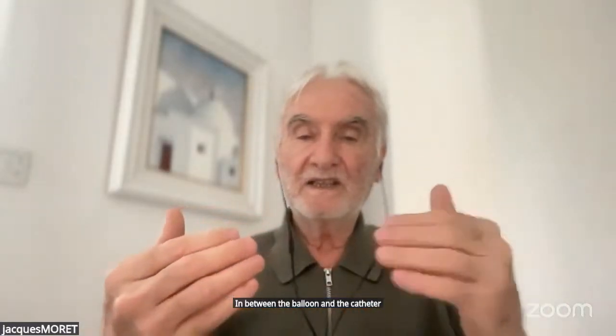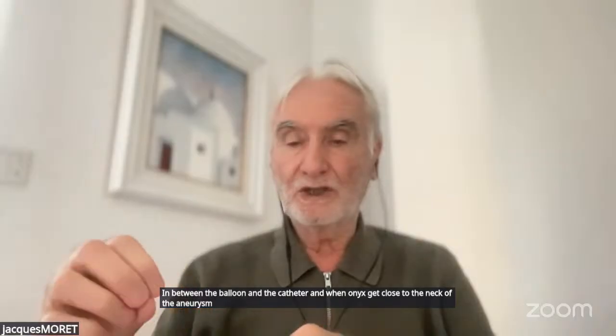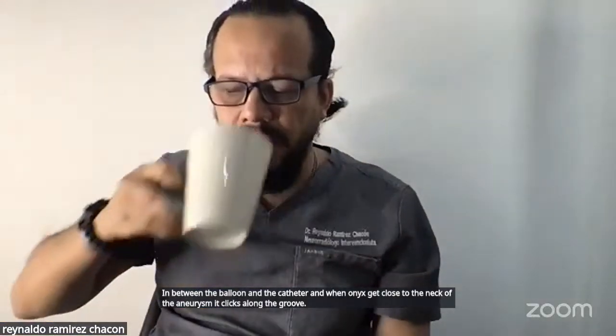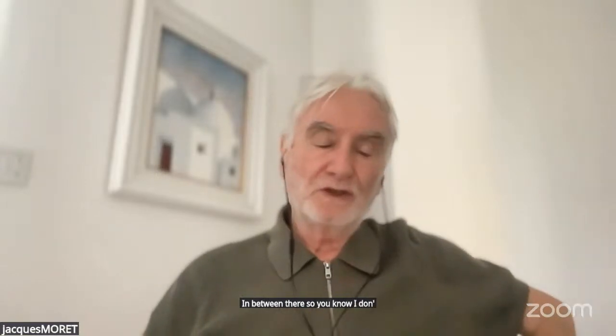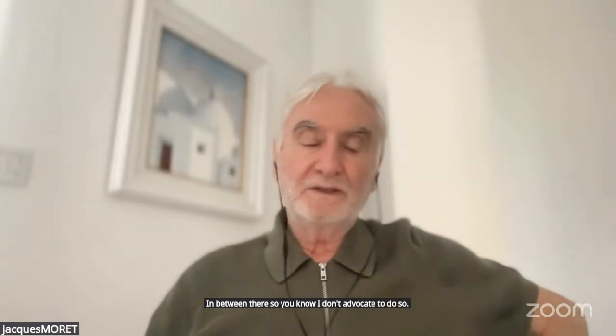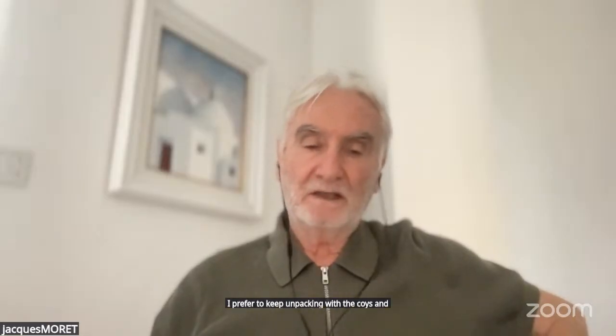When onyx gets close to the neck of the aneurysm, it leaks along the groove. So I don't advocate doing so. I prefer to keep on packing with the coils and then to put a flow diverter on the neck.